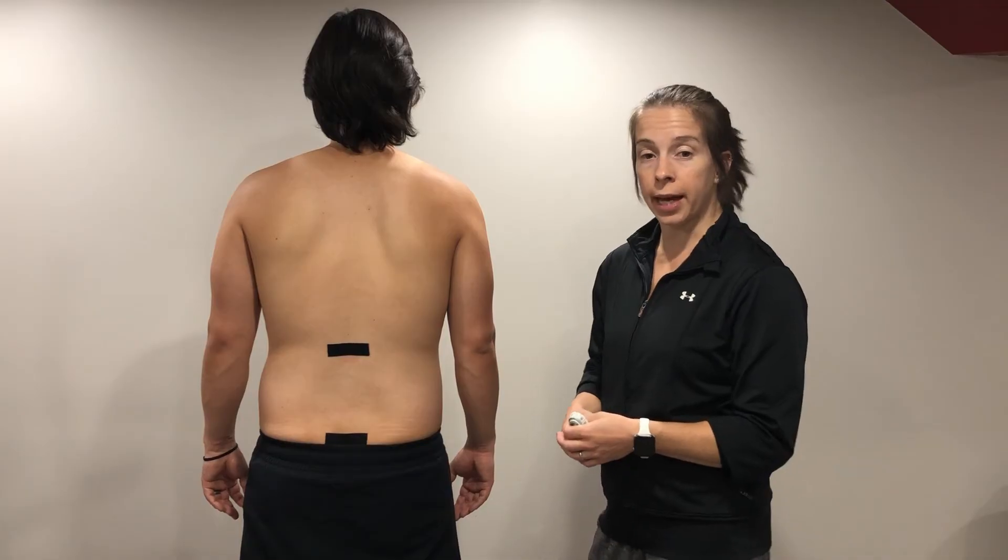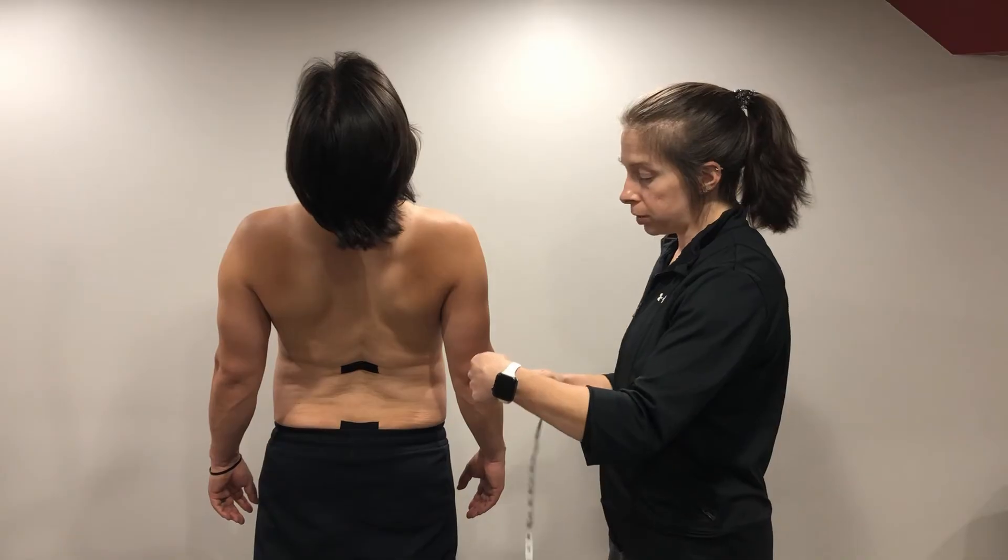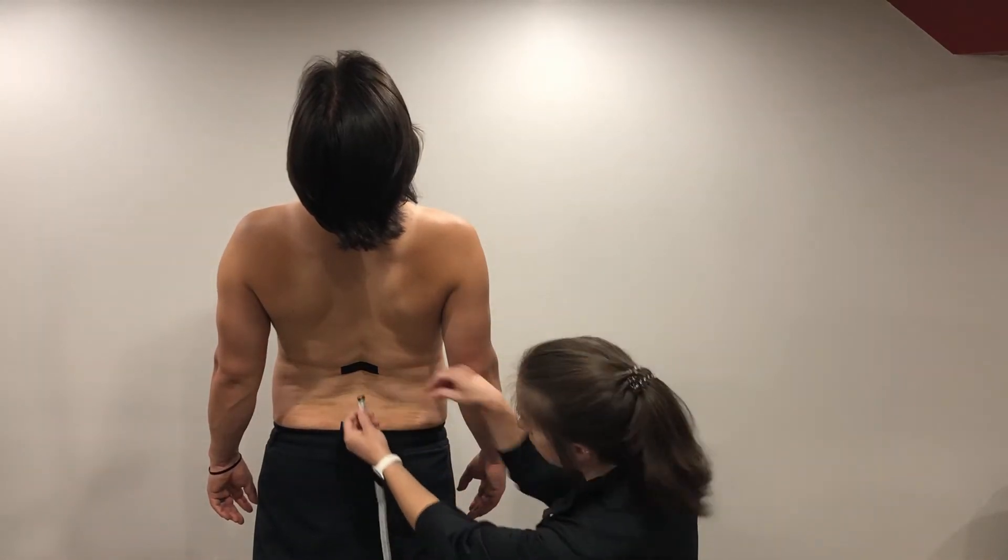Now I'll have the patient go ahead and extend through the lumbar spine, and I will take my tape measure and re-measure the distance between these two points.